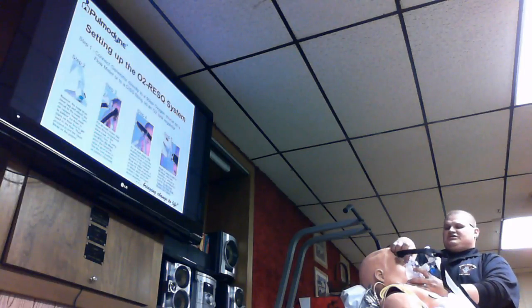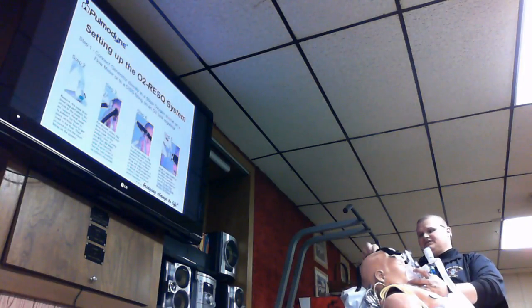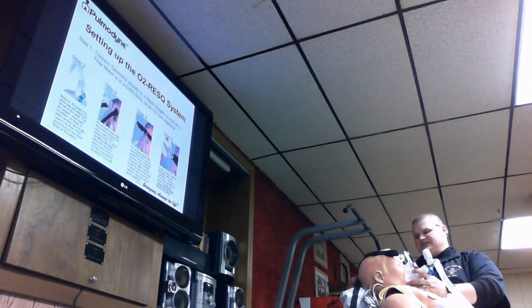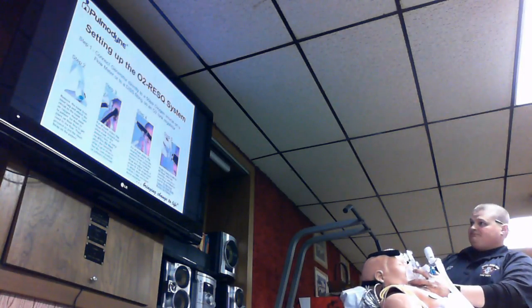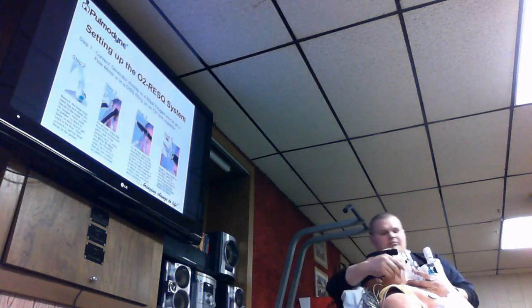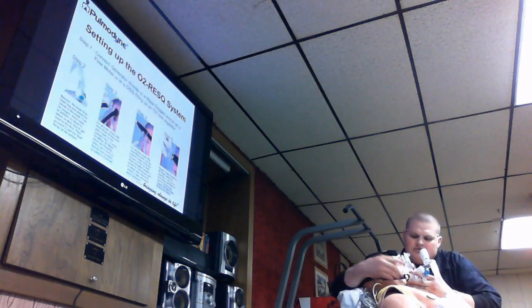So once you get this adjusted properly, what you'll do next is flip this over on top of his head like so. So this is all flush up against the back of his head, or your patient's head I should say. Get your straps around here, okay? Then you've got your little clips down here. You hit your clip on one, then you grab the other one, and you reach and clip it right here on this corner, just like on the other side, okay? Just like that, all right?